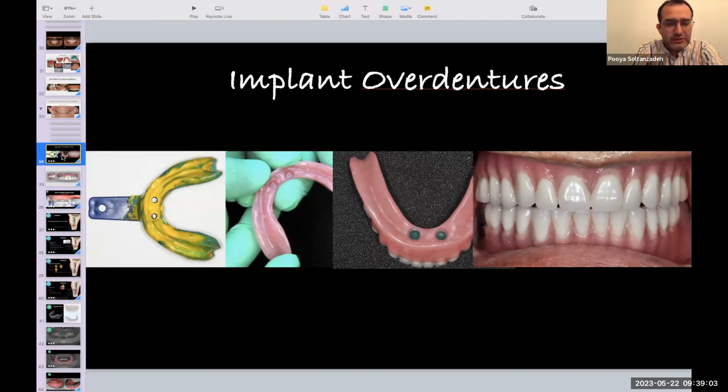And then Avident, I just talked to them a couple of days ago. They have a new technique where they can custom 3D print titanium over the cast, inside the denture, and then embed it and make it a one-piece denture. So it's a stronger denture, and it's very thin. So if you want to grind it or something, it can easily be done with that technique.